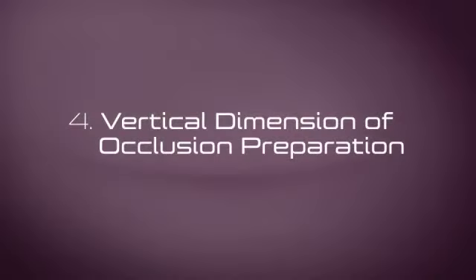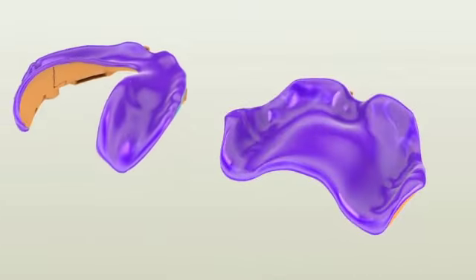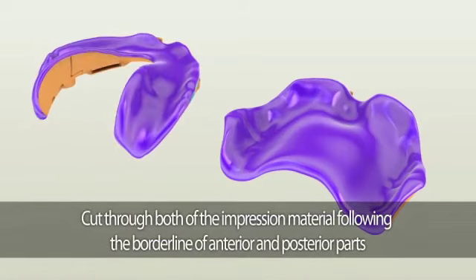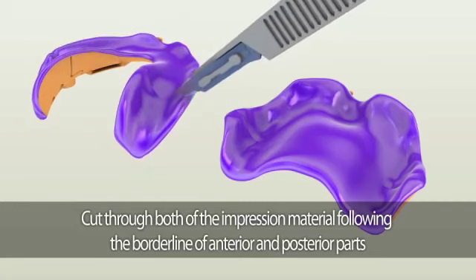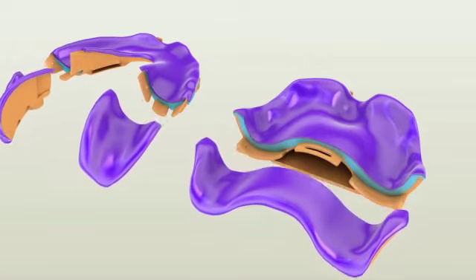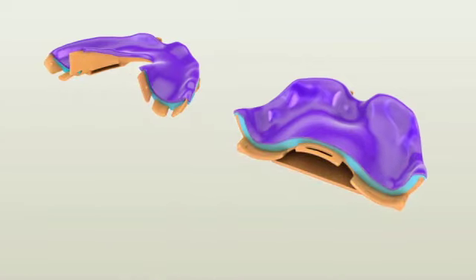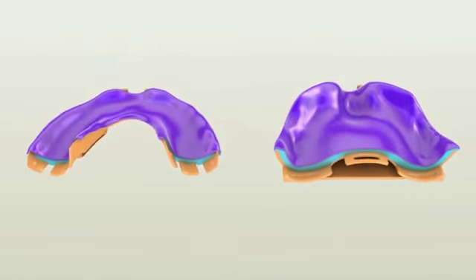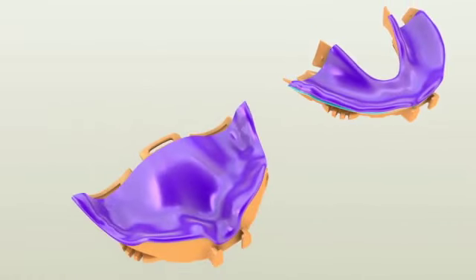Vertical dimension of occlusion preparation. Once you have taken both the maxillary and mandibular impressions, separate the posterior pieces of both trays using a surgical blade. Carefully cut through the impression material following the borderline between the anterior and posterior parts. When separating the posterior pieces, be careful not to break the tray by bending it — instead, wiggle it loose and gently pull it out. Trim the excess impression material covering the outer surfaces of both trays to help with loading the bite registration material later.